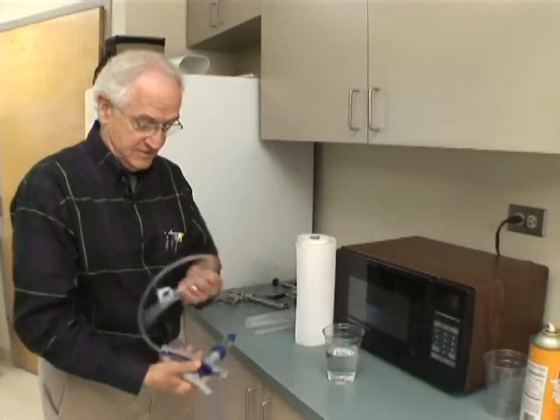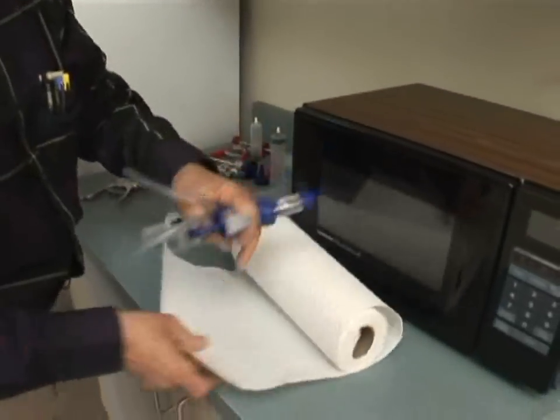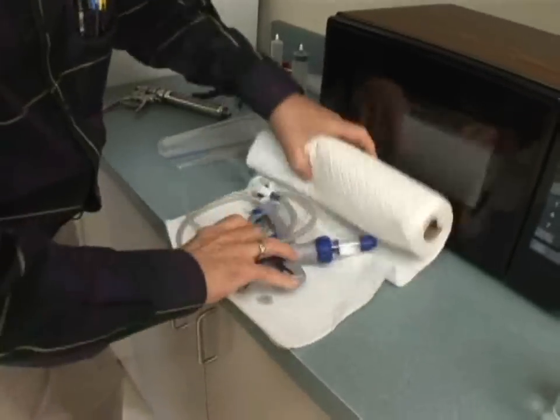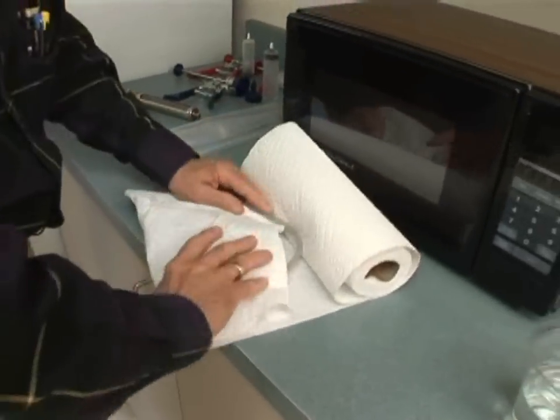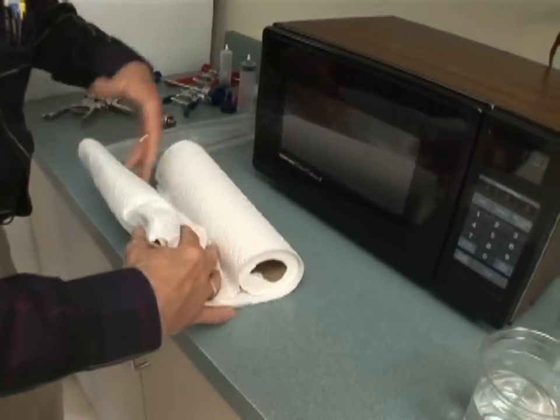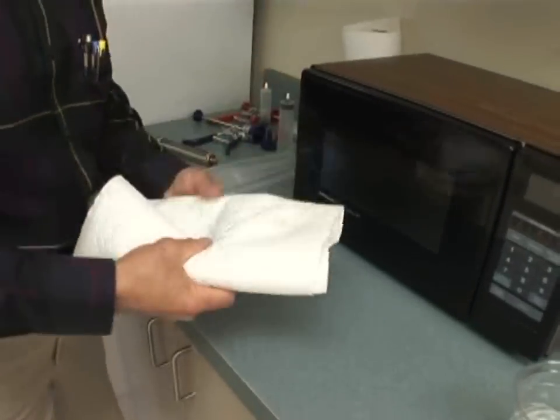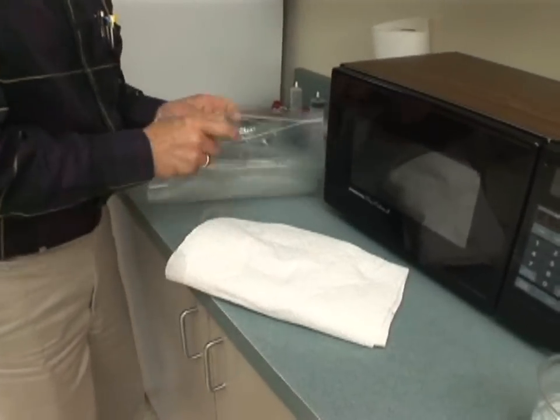I'm going to roll this syringe up and wrap it in paper towels. I want several layers. There's some metal in this paper towel, but let me assure you that if you wrap this and get it really wet, there will be no sparking associated with that metal.